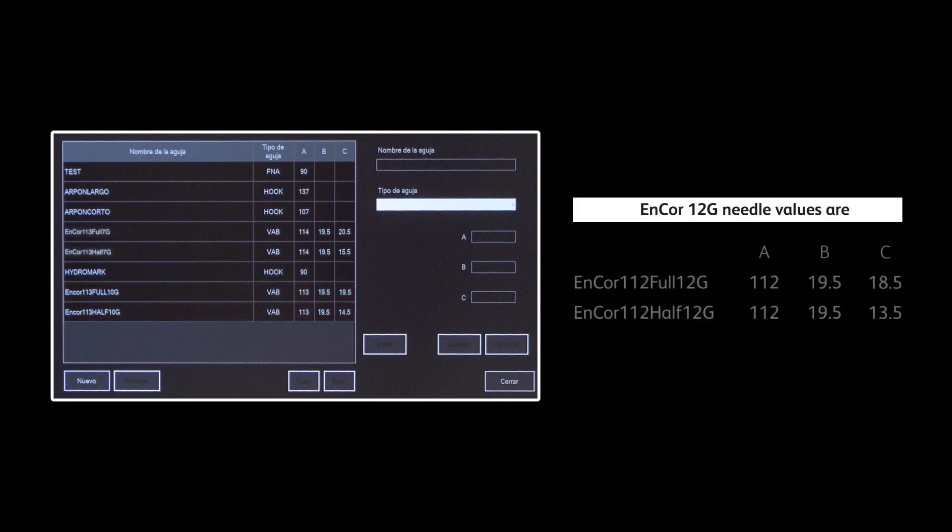Follow the same steps to add Encore 12G if needed. Accuracy calibration check must be completed for each one of them.